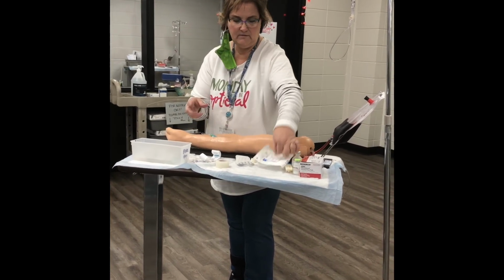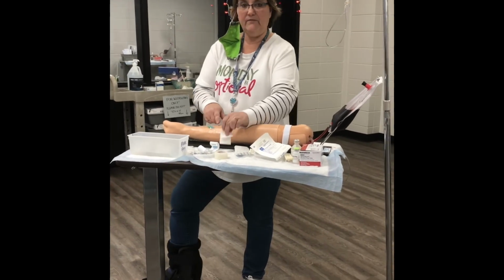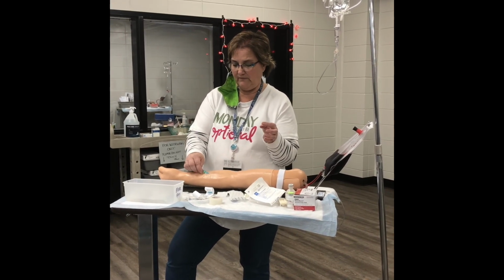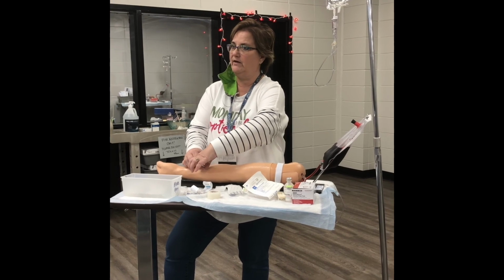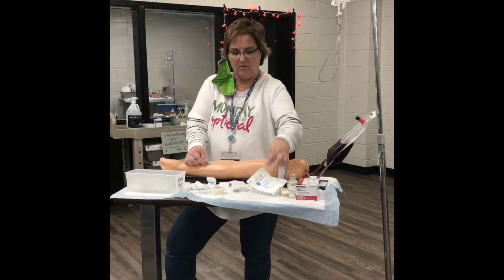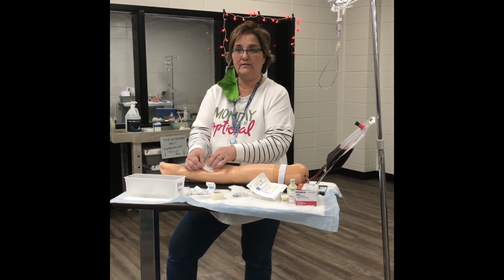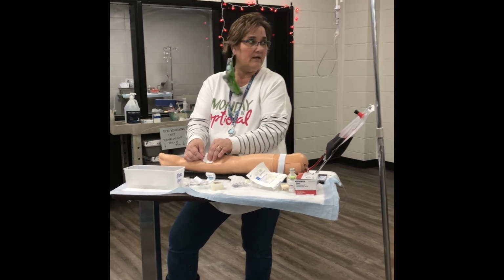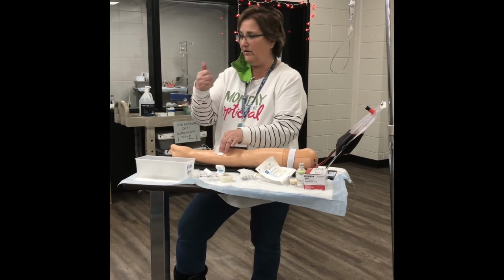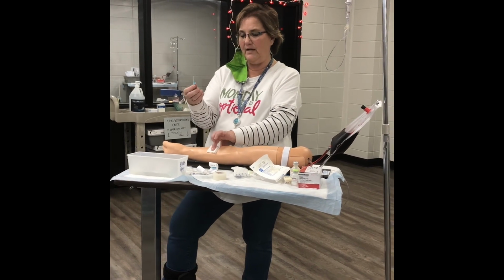Now, you want to take the tape off of this. You don't want to try to pull it all off at the same time. You've got gloves on, so it's hard, but if you'll hold this and lift it up a little, you can hook your finger under that. I'm just trying to tell you how to do it with these IV arms. Pull all that off. Then before you pull it out, you want to cover the site with whatever you're using, cotton ball or this dressing, before you pull it out. Because if you pull it out and it flicks a little bit, it could get in your eye if you don't wear glasses or whatever. So straight out, immediately apply pressure.